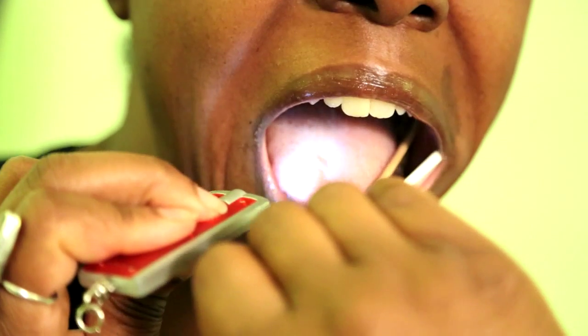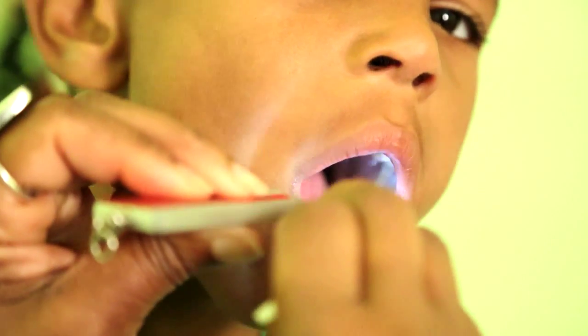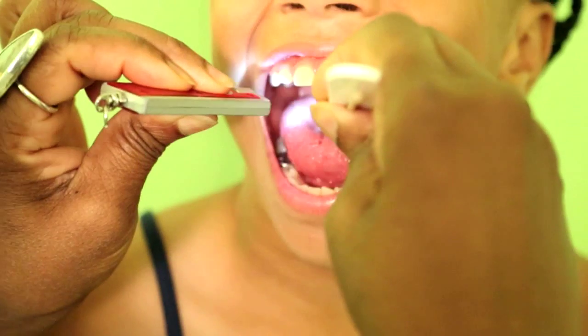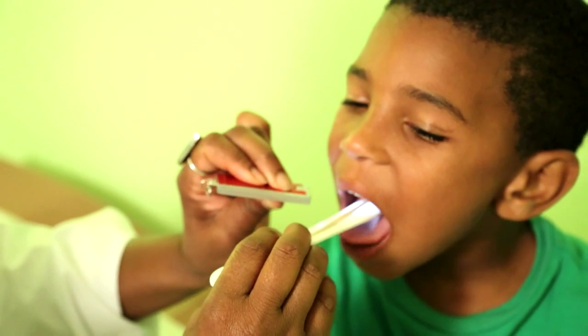Simultaneous. So there are three benefits: better visualization, freeing one's hand, and allowing the practitioner to take a specimen of the back of the throat or swabbing the back of the throat at the same time.